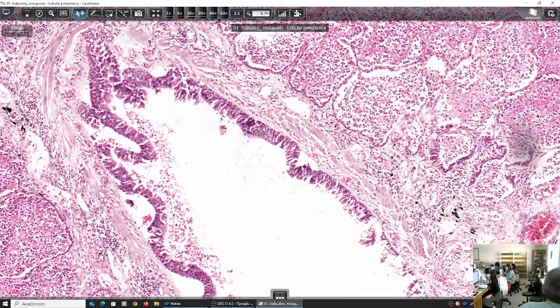When we see these cells in a bronchus wall, we understand that it is of an adequate size. It's not a terminal bronchiole or a respiratory bronchiole. What is the tissue around this specific bronchiole? Yes, smooth muscle tissue. This is the tissue that, when contracted in asthma, narrows the lumen of the bronchus, and we have wheezing of the air passing through a narrowed bronchus. But that's not for today. So this is a bronchiole, quite a big one.